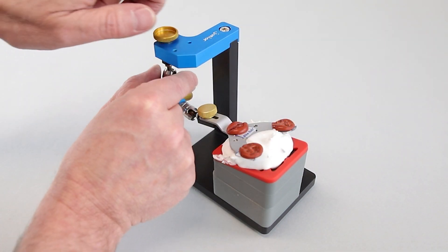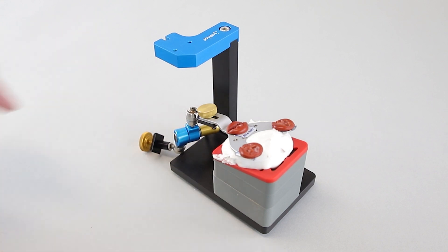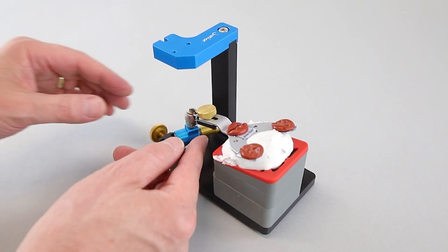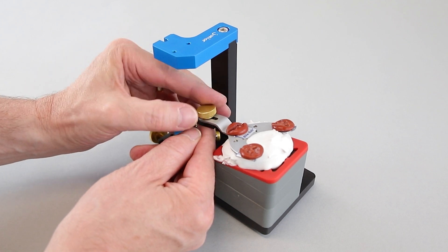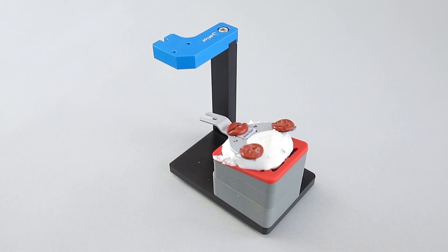After the plaster is hardened, you can remove the 3D joint support. First, open the fixation nut. Then open the upper fixing screw. Finally, open the fixation screw from the bite fork and remove the joint support from the Transfer Stand.